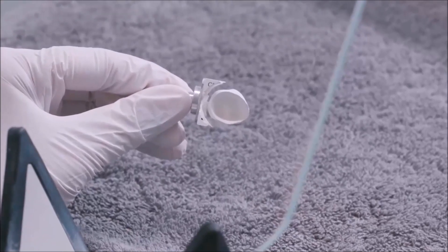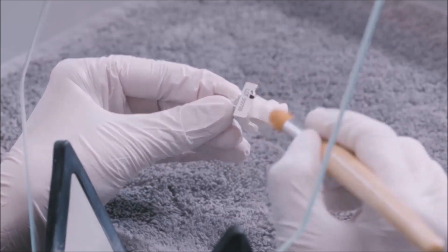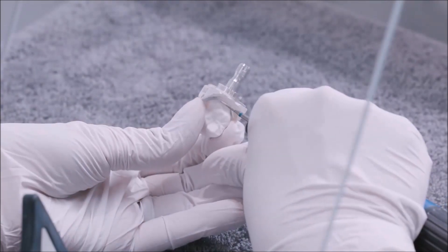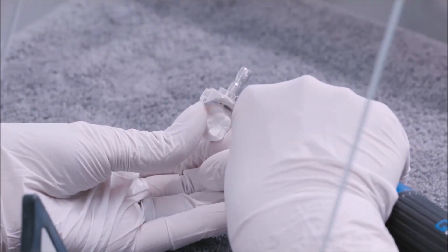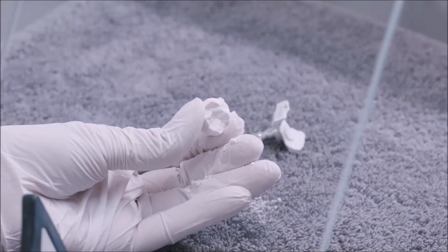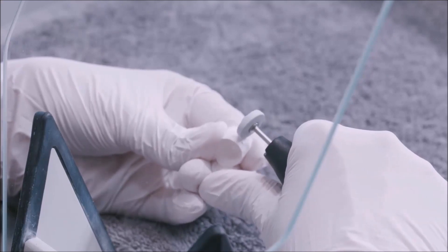After removing the milled restoration from CEREC Prime Mill, we use a brush to remove the milling dust. Please make sure to only process un-sintered CEREC MTL Zirconia with gloves and under suction. To separate the restoration from the block holder, we hold it with one hand to ensure it doesn't simply fall off. The sprue location can be smoothed with a diamond rubber wheel.